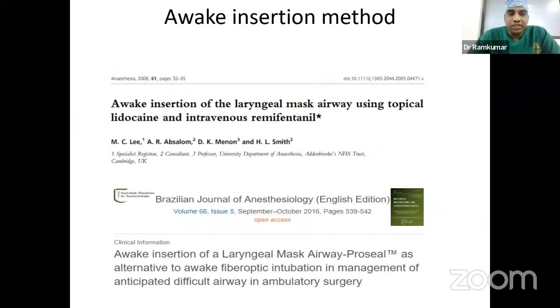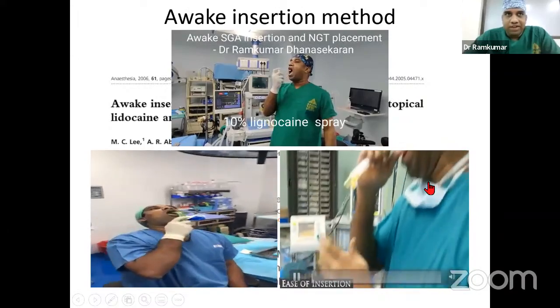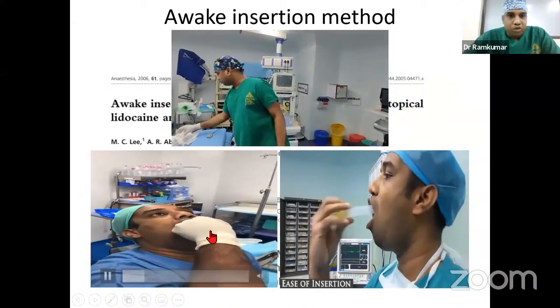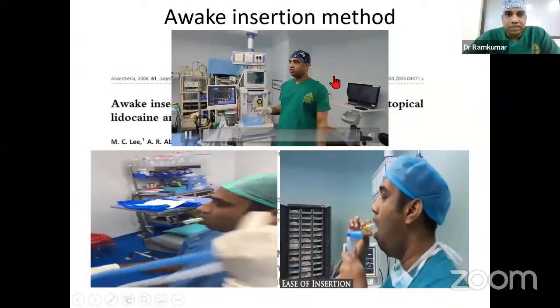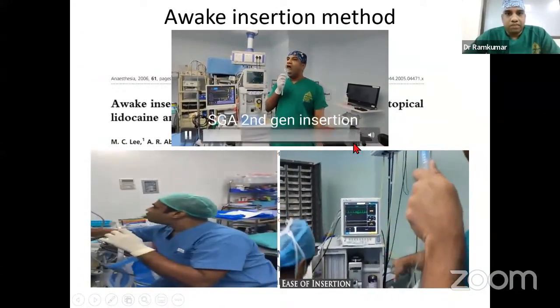Coming to another technique which has been reported, it's called the awake insertion technique. I thought instead of trying on a patient, I'd try on myself. On the right side, I'm using a size 4 Baska mask. On the left side, it's an Ambu AuraGain inserted. And this is the LMA Supreme, where I added 2 puffs of 10% xylocaine spray. After that, I could manually insert it.